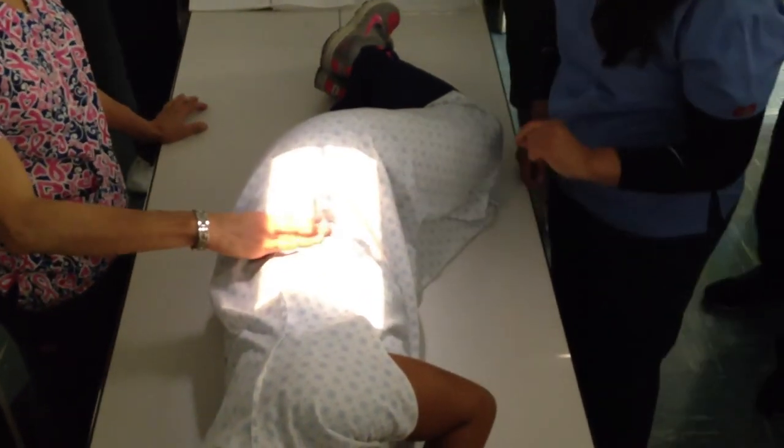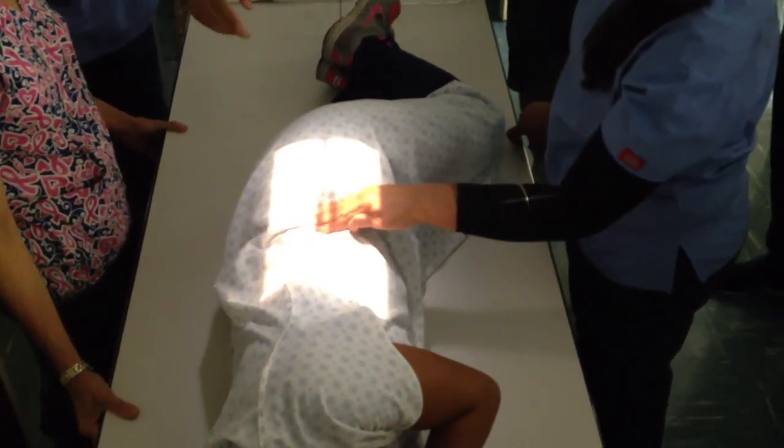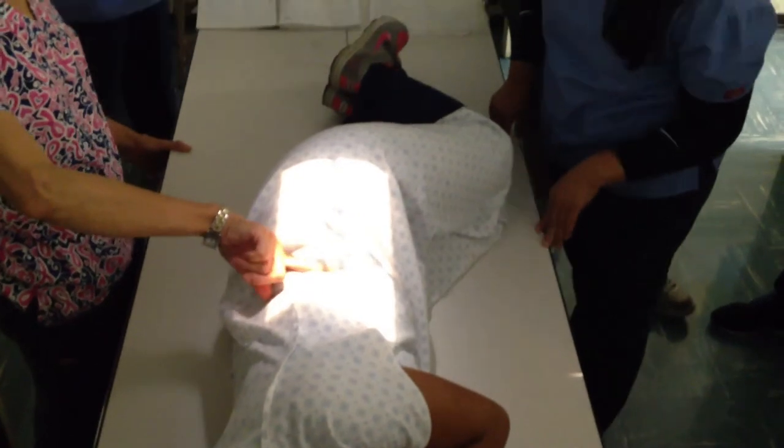On her, you can collimate a little bit more — not to a shadow. But I think you've got too much spine here. Close it up this way. Is she using crest right now? Three fingers? I believe she is going crest — three fingers above crest, or center at the lower costal margin. That's another option.